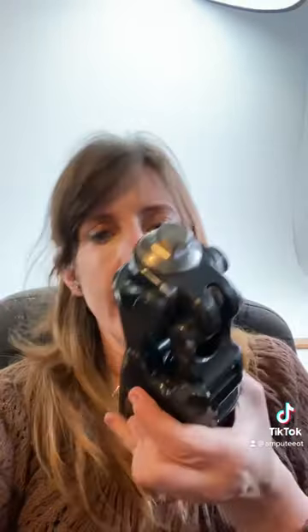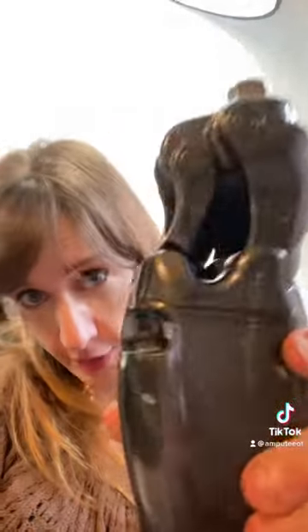Hello internet, this is Christina the amputee OT and I have a favor to ask. I recently bought this Alex prosthetic knee from somebody on Facebook Marketplace and it does not come with a charger. I don't know if it works or not, and the charger is like $350 to buy, so I'm hoping somebody out there has a charger for an Alex that I can borrow. I just want to charge it and see if it works, and if it works then I'll buy the charger.